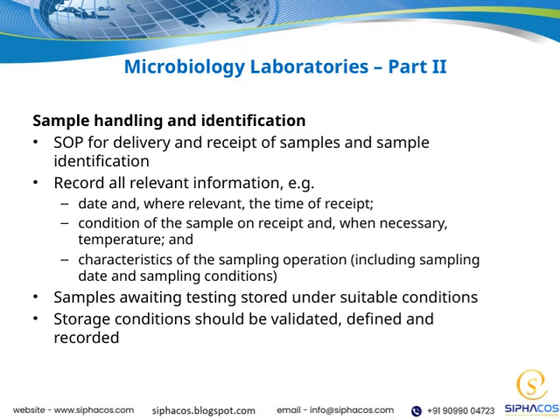Now let's focus on the key aspects of handling and identifying samples. First, it's essential to have a clear SOP, or standard operating procedure, for the delivery and receipt of samples, as well as their identification. This helps ensure consistency and accuracy throughout the process.